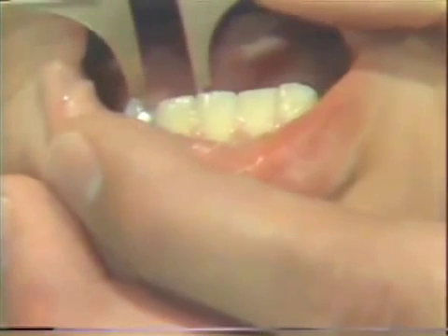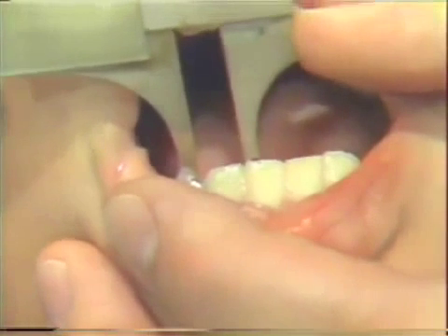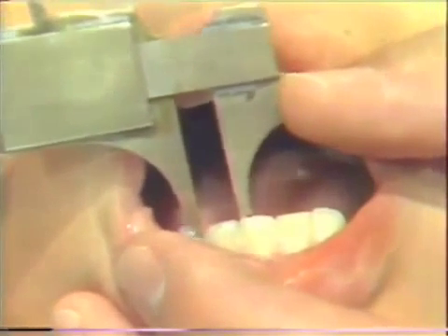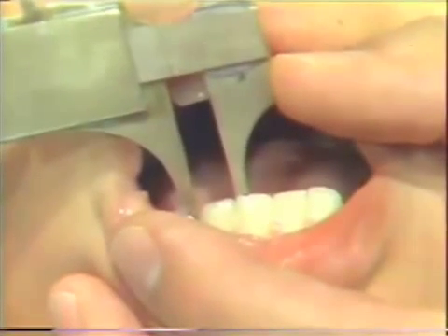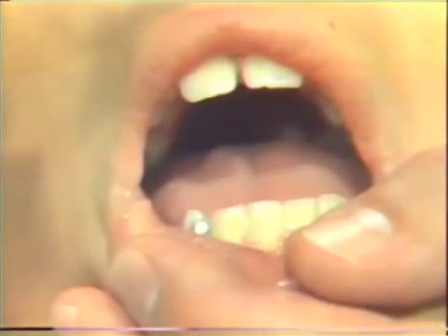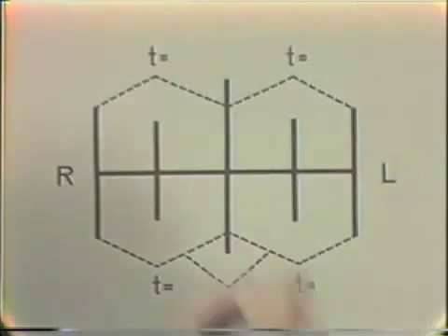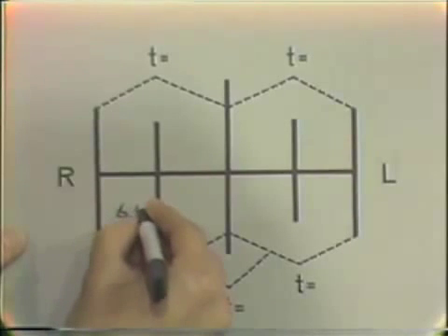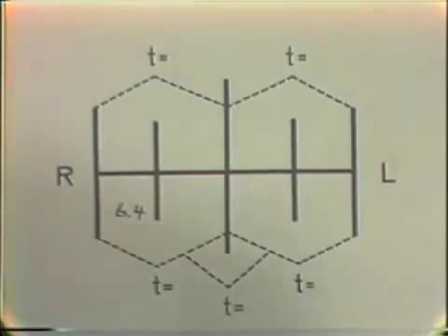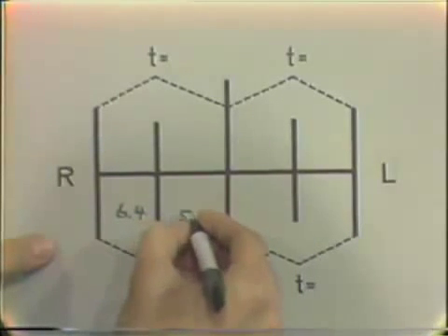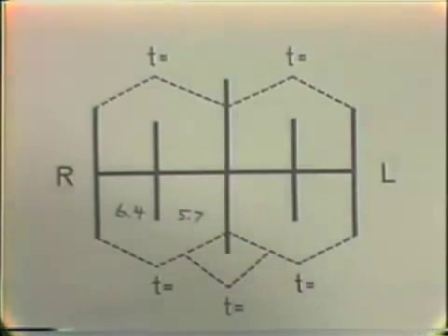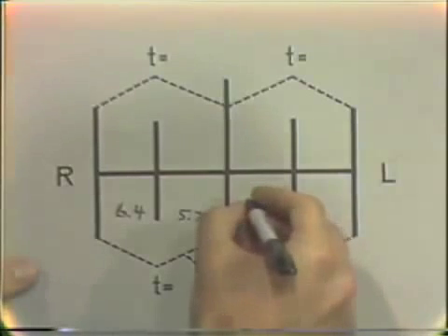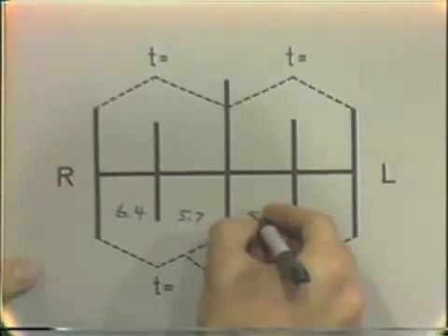We're measuring at the widest mesial distal diameter, placing the Bowley gauge so that it goes down the long axis of the tooth. The width of the lower right lateral incisor is 6.4 millimeters. The right central incisor width is 5.7 millimeters. On the left, the left central incisor is 5.4 millimeters, and the left lateral incisor is 6.2 millimeters.